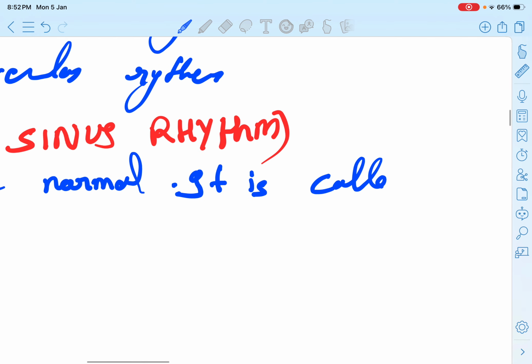Common ECG rhythms. We will study sinus bradycardia, sinus tachycardia, atrial fibrillation, ventricular tachycardia, ventricular fibrillation. Always check the patient first, not only the ECG. A loose lead can cause a false ECG that looks like ventricular tachycardia, ventricular fibrillation, or an emergency rhythm.